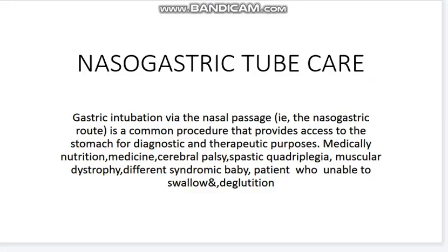A nasogastric tube via the nasal passage is a common procedure that provides access to the stomach for diagnostic and therapeutic purposes. Medically, it is used for nutrition and medicine in cerebral palsy, spastic quadriplegia, muscular dystrophy, different syndromic babies, and patients who are unable to swallow.